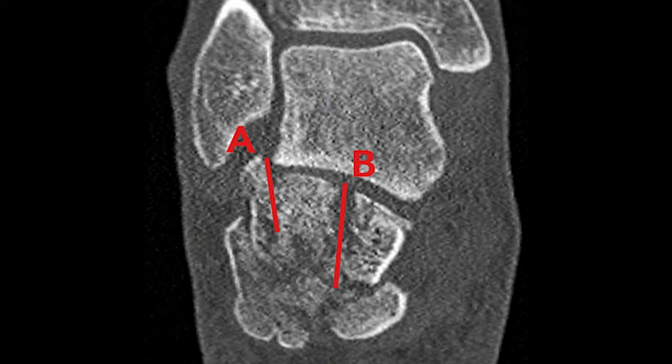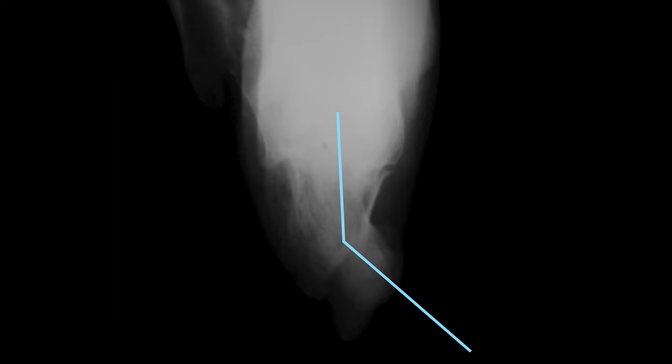We can also observe that the lateral articular fragment tends to displace into the ankle joint, so it is necessary to reduce it in an open manner through the sinus tarsi approach. At the axial view, we can see varus displacement of the calcaneal tuber, which can potentially lead to such sequelae as posttraumatic deformity.